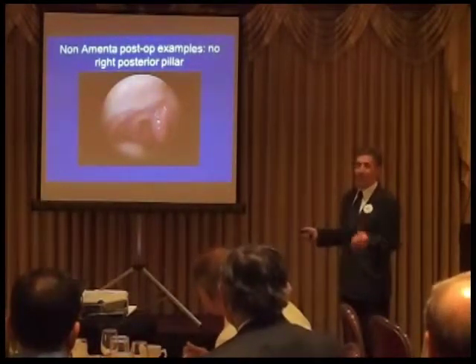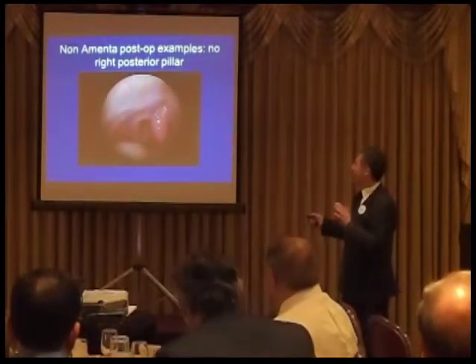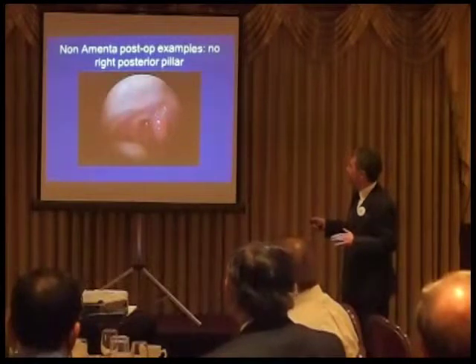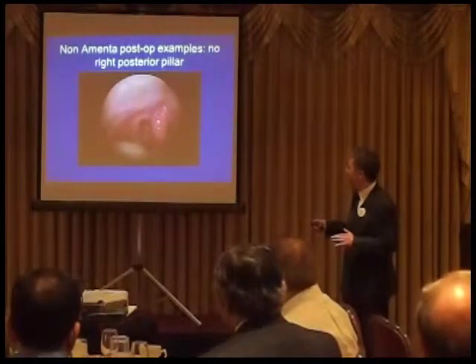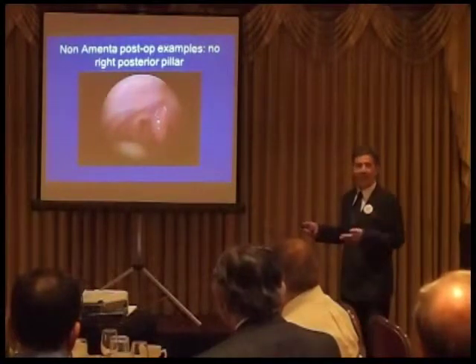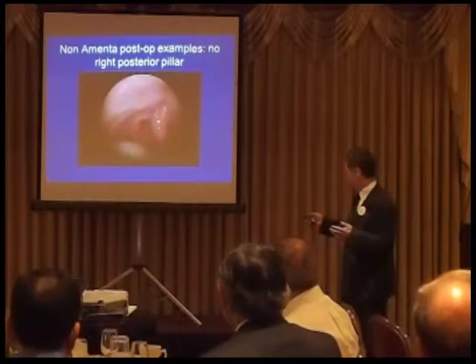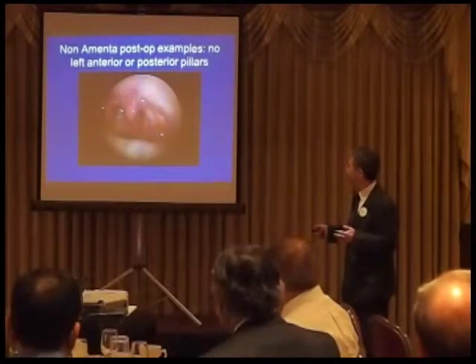But these are those people that showed up in my office over the last couple of weeks. I said, well, I got to have some pictures. These are not my tonsillectomies, but you can see how sometimes people take off the posterior pillar here. There's not much anterior pillar here, so just clean it out, and whatever you get in your snare or whatever you cut away, as long as you get the tonsil out, the patients just have to lump it. Here's her other side.